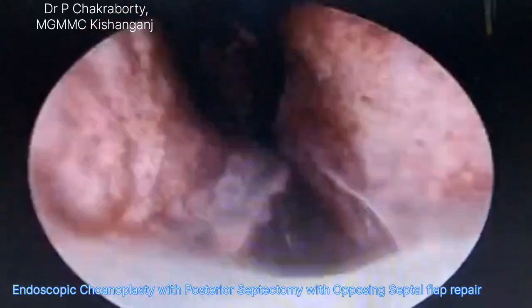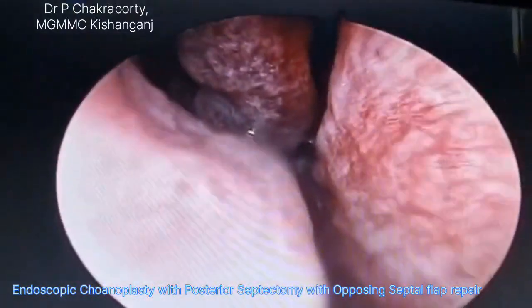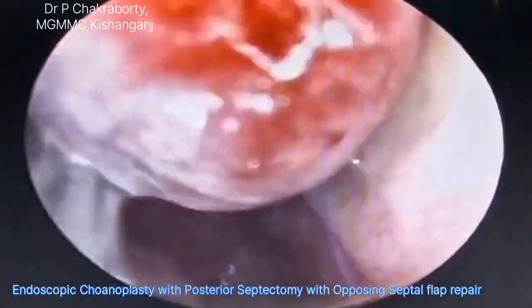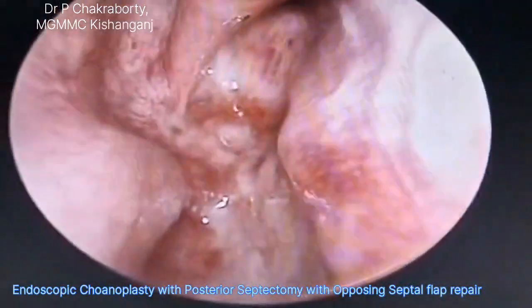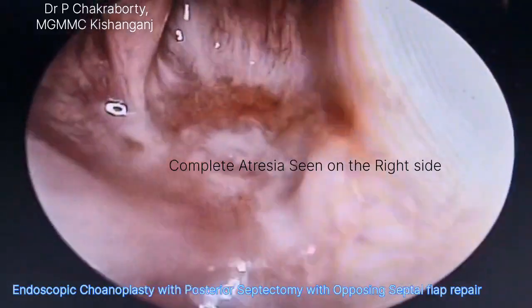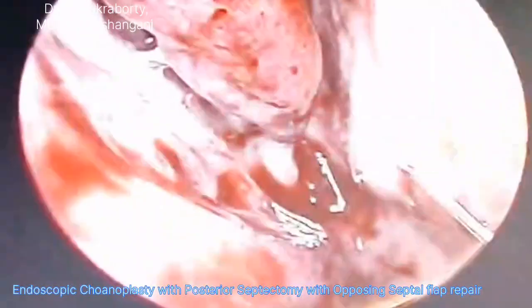And now we are clearing the right side mucus secretions. As you can see, a lot of mucus is there, and once we go towards the posterior end of the nasal cavity, that is the choana, we can see a complete wall of atresia seen on the right side. There is no opening left in the right side.